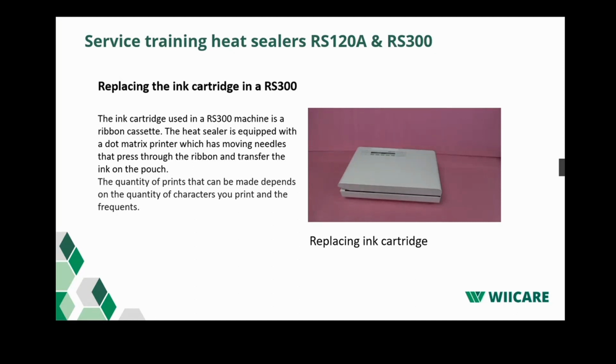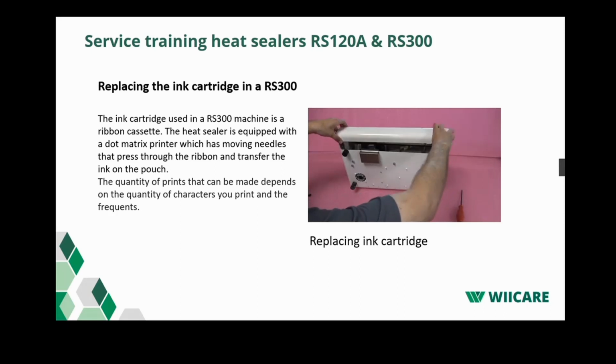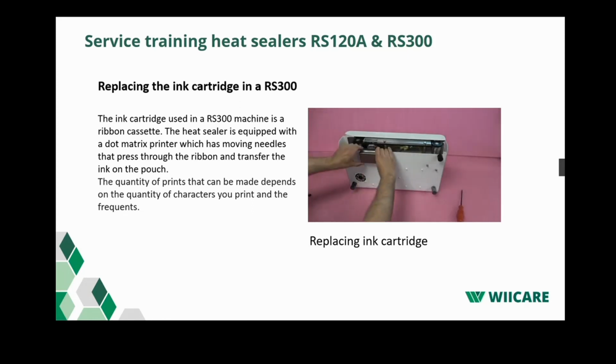Hello, in this video I show you how to replace the ink ribbon. A new ink ribbon cassette is required when the text becomes light gray instead of the usual black or dark gray. First, disassemble the lower front cover. You do this by loosening the knurled screws. Now remove the lower front using a screwdriver. Also remove the print cover. Clean it if necessary.